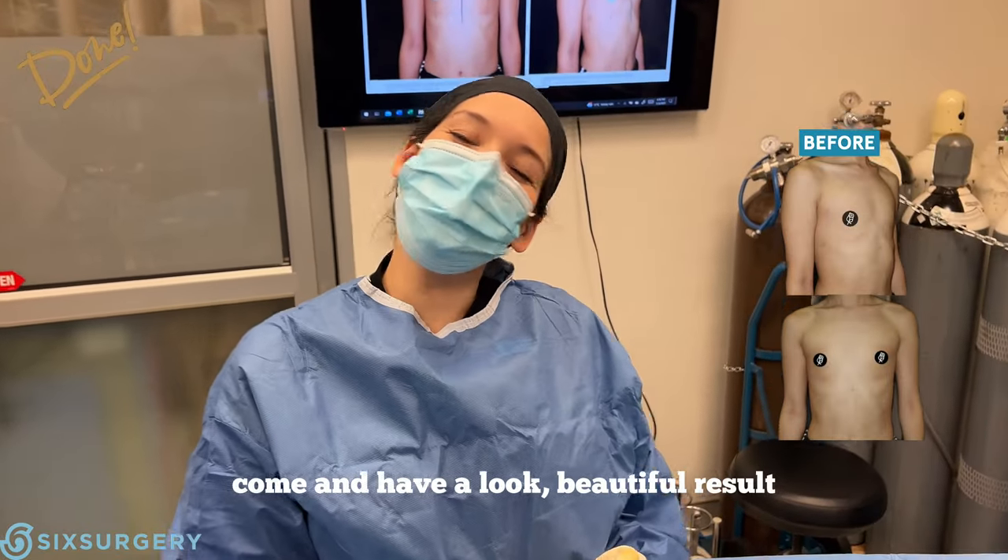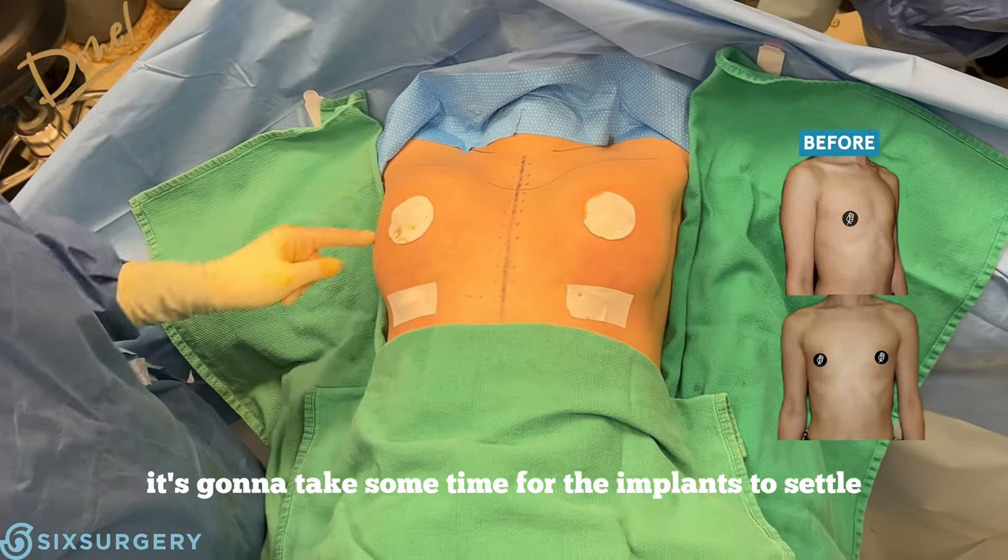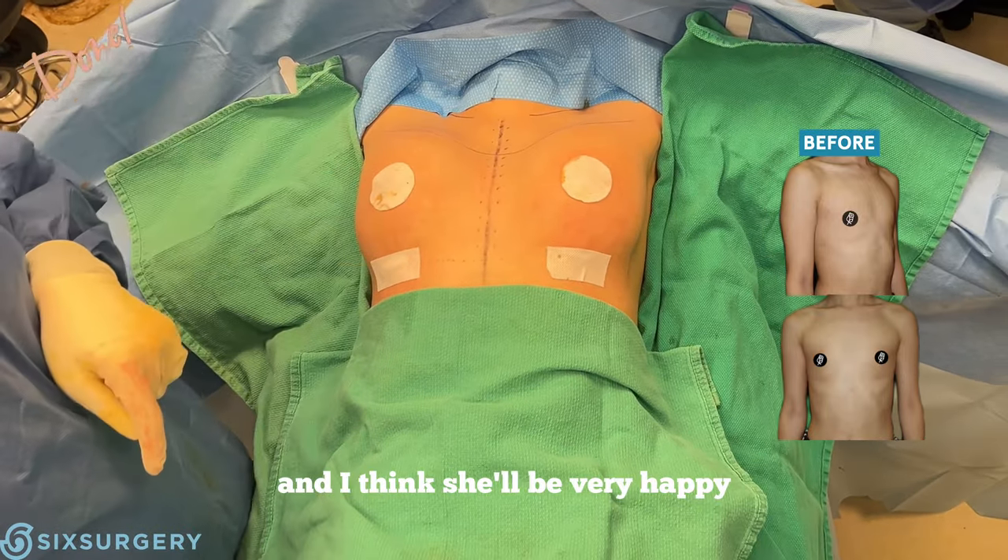And we're all done — come have a look. Beautiful result. It's going to take some time for the implants to settle. This is a lovely round shape and I think she'll be very happy.